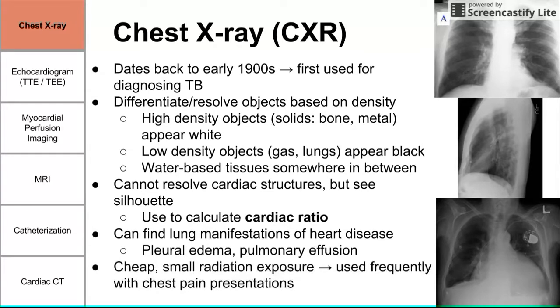And just in summary, chest x-ray is cheap. There's a small radiation exposure. It's just one quick x-ray, and it's used frequently in the emergency room when people present with chest pain.